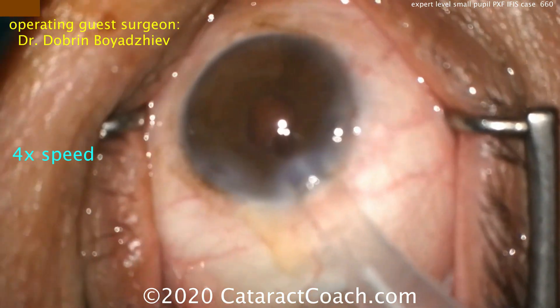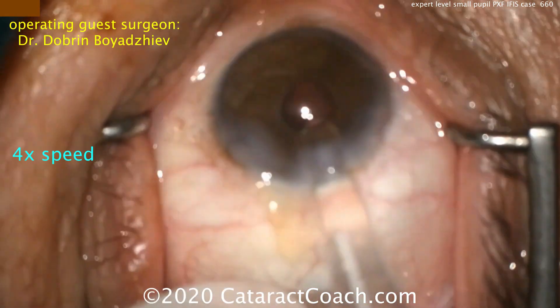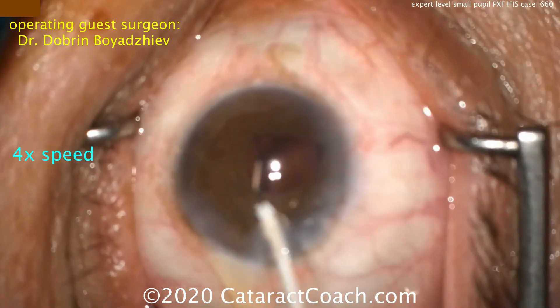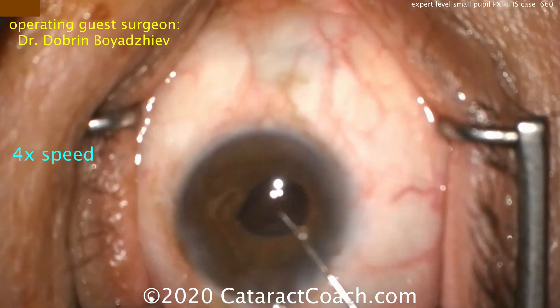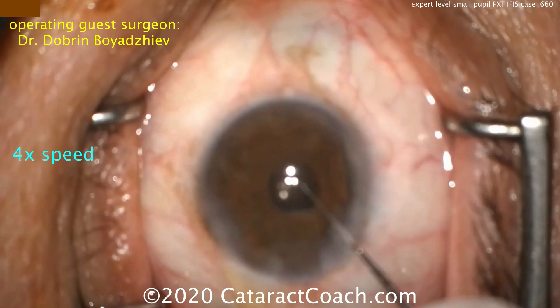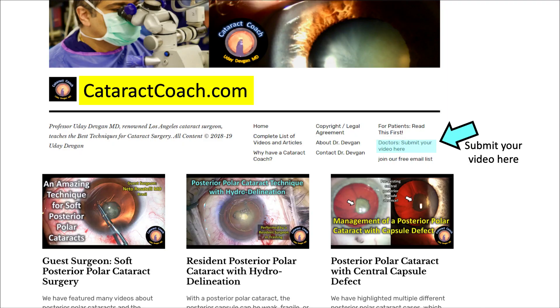Just know that there are other options available here. Placing the IOL — nicely rolled up in the injector — can go right through that small pupil and place it in the capsular bag. Now let's ensure that it's completely in the capsular bag so that all heals well. Beautiful case.